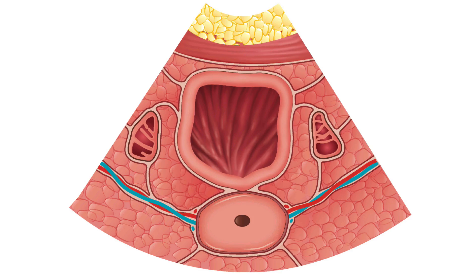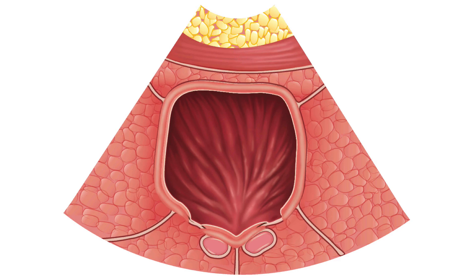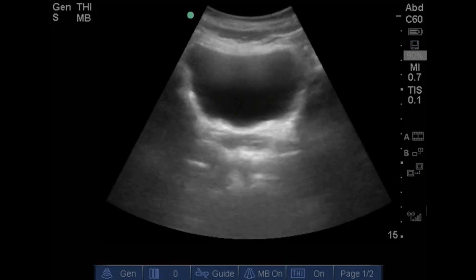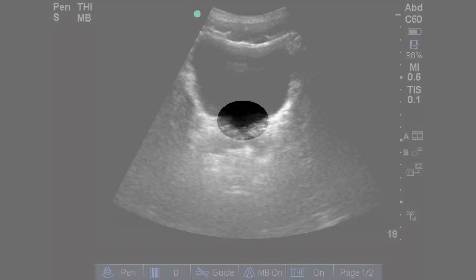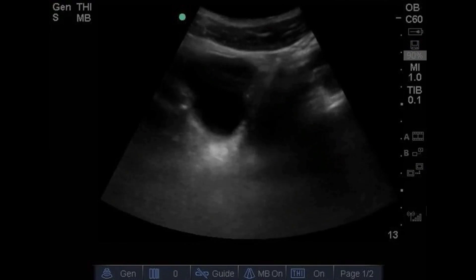Next we're going to image the bladder and evaluate for ureteral jets in the transverse view. View the bladder in sagittal first to confirm identification, then switch to transverse. The bladder will be somewhat square to rhomboid in shape. We're looking for the ureteral entry into the bladder for ureteral jets. Finding the ureteral implantation may be difficult, so instead look for the trigone — the small dip or depression in the posterior wall of the bladder. Here in the transverse plane you can see the trigone and the ureteral entry, which is visible but not always apparent.